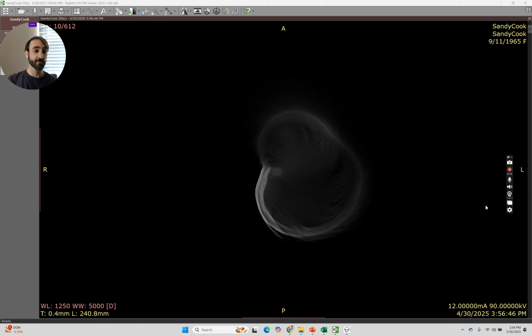I was using several different tools on my computer, like a measurement tool, an angulometer tool, just different things that would overlay on top of the cone beam that would allow me to measure the slopes and the C over A, because those softwares are not built into the Radiant software. And so I ended up creating a program called Toolkit, and I'll open it up and just show you real fast.